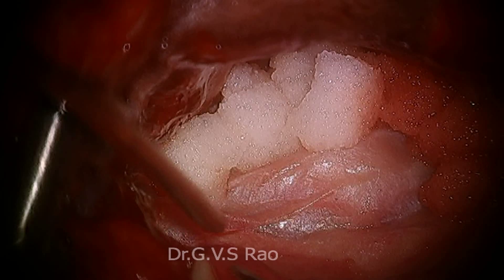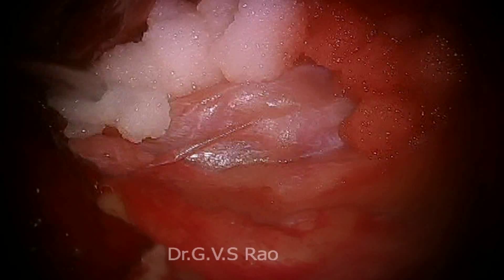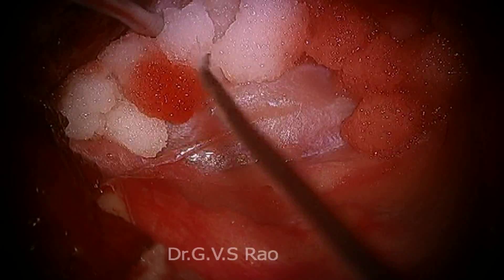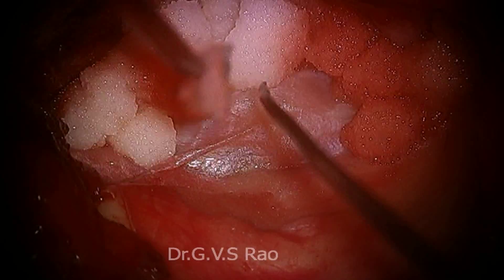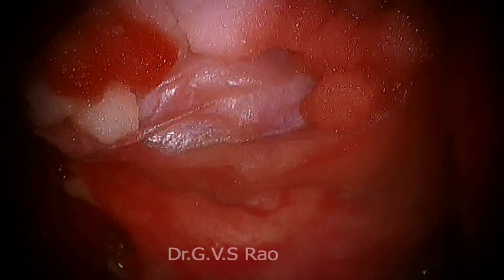I will tell you something later. Dr. Chaitanya Ra will explain something about this case to you. Now see — such a bad case, how beautifully we reconstructed. We gave support, we reconstructed the tegmen antri, we reconstructed the tegmen tympani, and no cavity. The tip was obliterated and nobody will believe it. Tomorrow the patient goes, and I want to show all of this under local anesthesia.